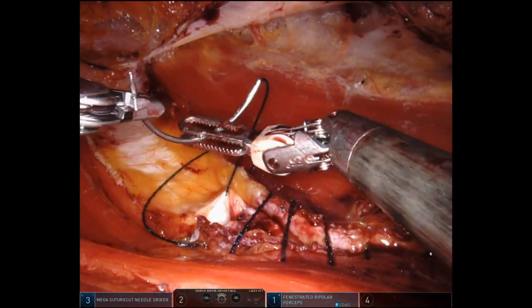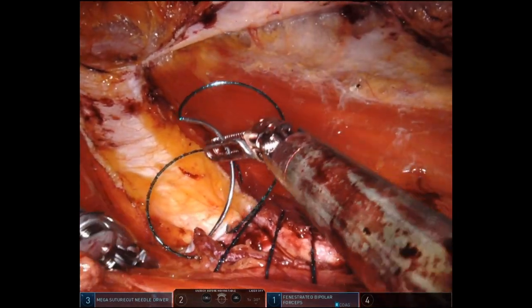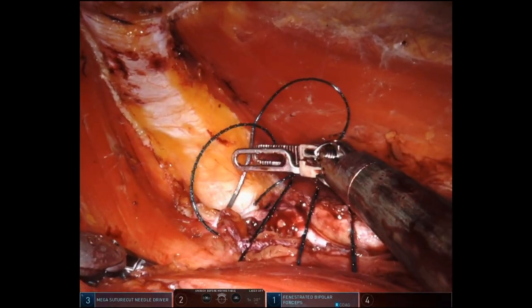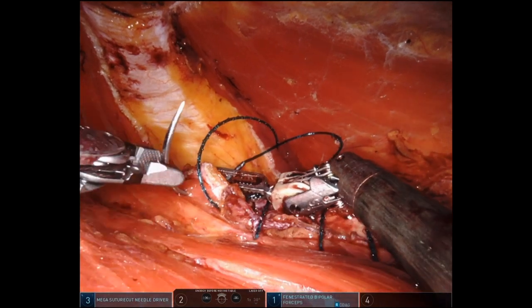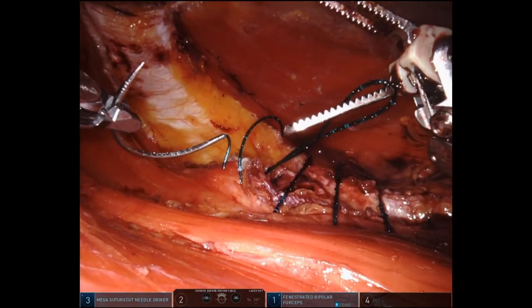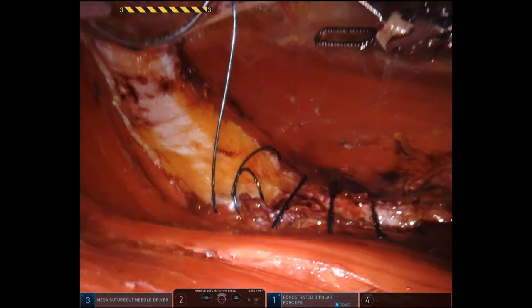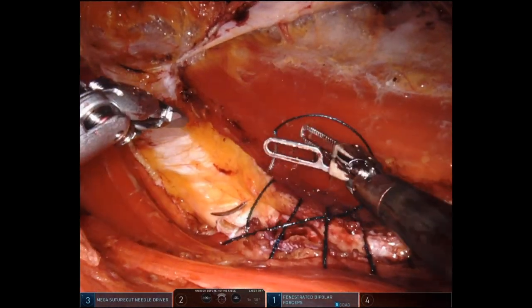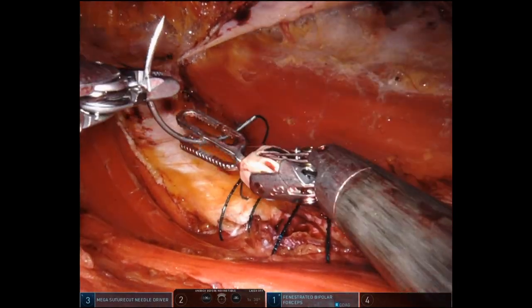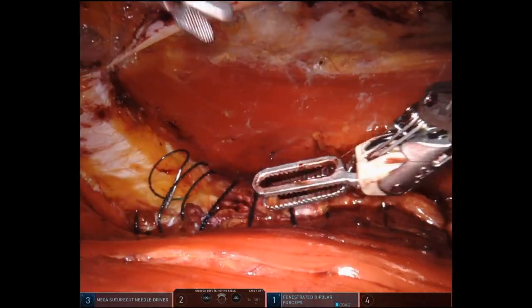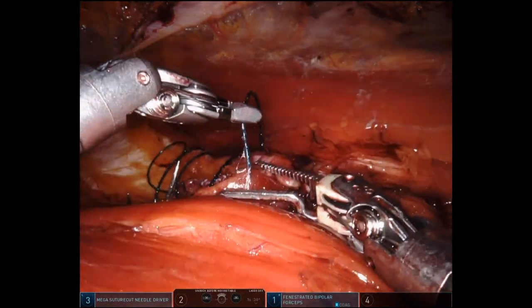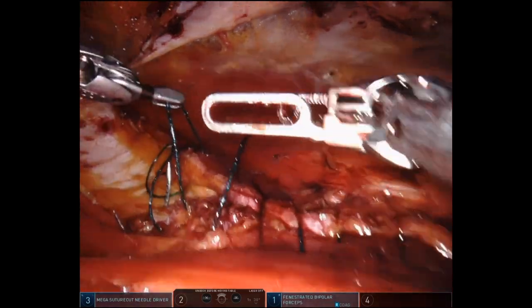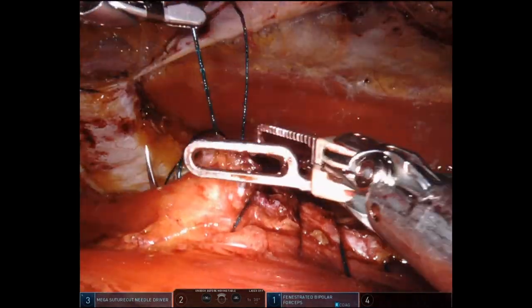Now I'm operating the fenestrated bipolar with my right hand and the needle driver with my left hand. Because the fenestrated bipolar comes in at a better angle, it's easier for me to suture. If I had to do a lot of suturing, I would have also swapped out my instruments to put the mega suture cut where the fenestrated is right now, but I wasn't planning to suture much more, so I just kept the instruments in the same locations.